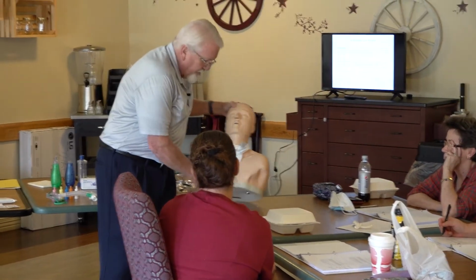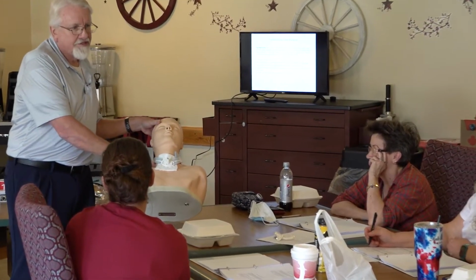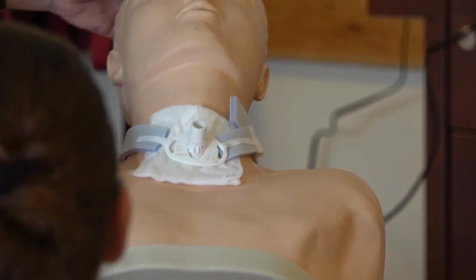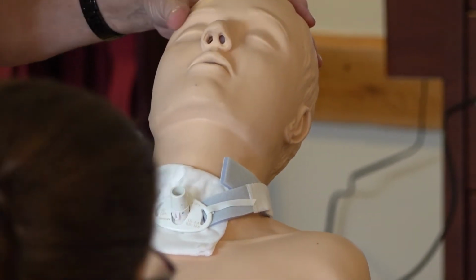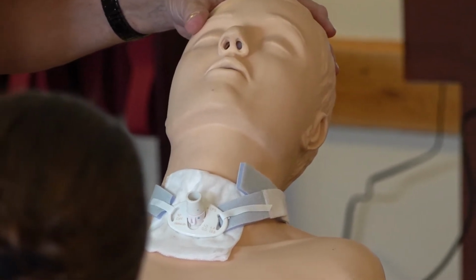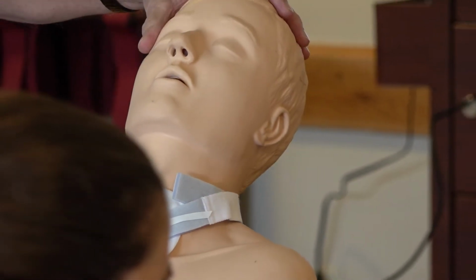So Bob's laying there. One, he's a trach, so they should never go below 35 degrees. Okay, make sure they stay up. He's got a trach mask on, and he's getting oxygen. So I'm going to make sure that I put a pulse ox on his finger, so that way I can monitor him while I'm doing all this to him.